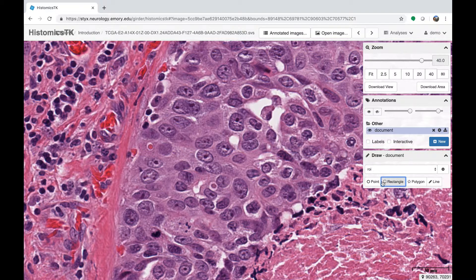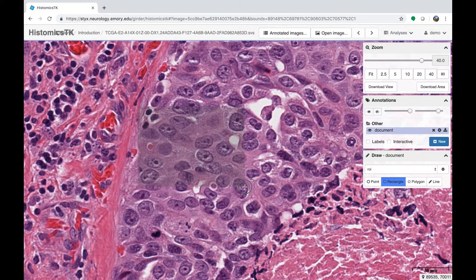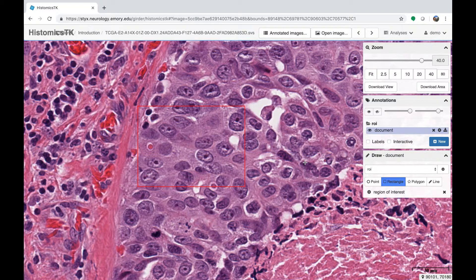Click Save to save our import, then select the rectangle tool and draw a rectangle by clicking and dragging. The shaded region represents the rectangle, and when you release, the rectangle will be created. Next, we're going to annotate the nuclei in the region of interest.